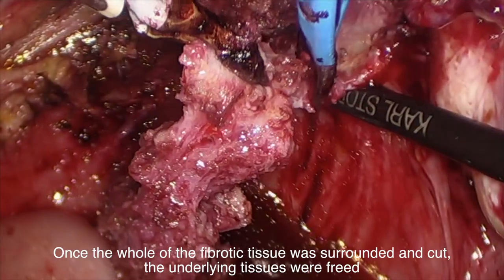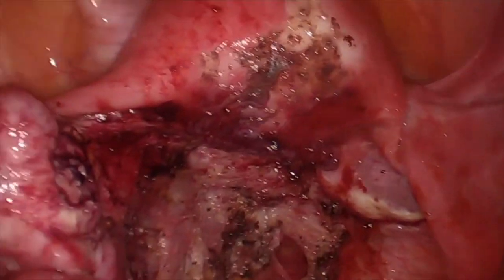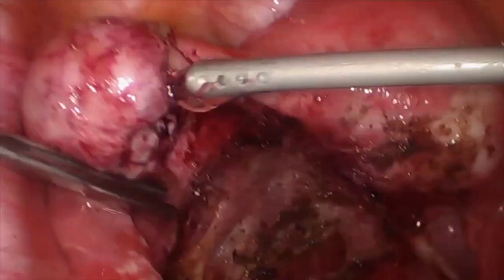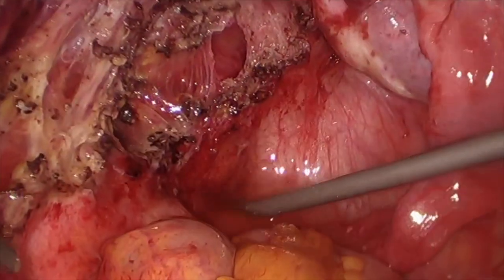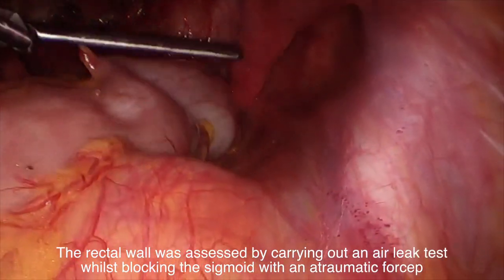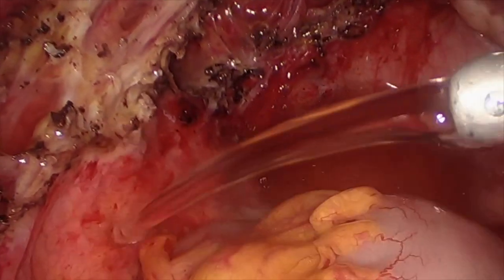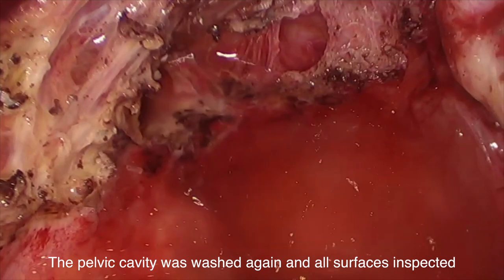Once the whole of the fibrotic tissue was surrounded and cut, the underlying tissues were freed. All surfaces were washed and cleaned and hemostasis was checked. The rectal wall was assessed by carrying out a leak test whilst blocking the sigmoid with an atraumatic forcep. The pelvic cavity was washed again and all surfaces inspected.